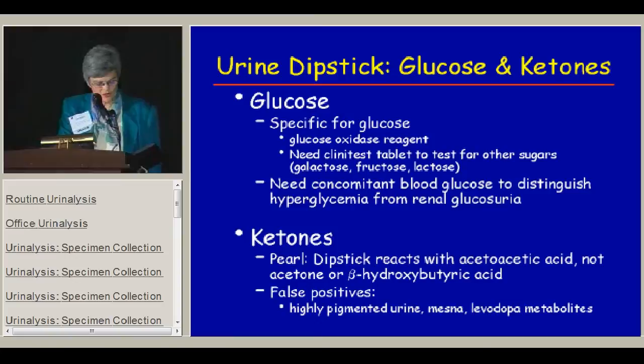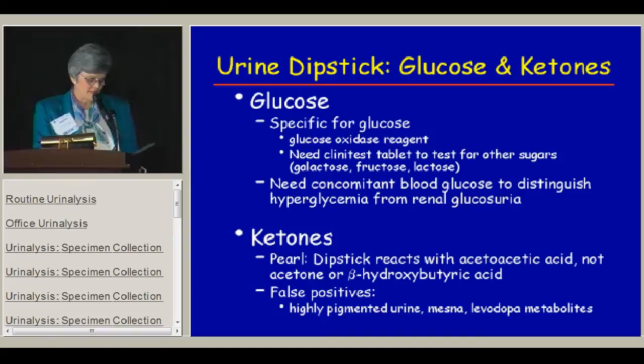The urine glucose and ketones are important: the glucose test is specific for glucose and not for other sugars, so if you want to screen for other sugars, you must do a Clinitest. For ketones, the dipstick really reacts just with acetoacetic acid and not with acetone or beta-hydroxybutyrate, so it may not give you a completely accurate assessment.